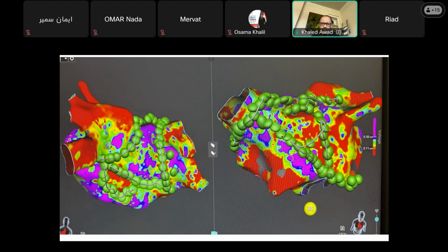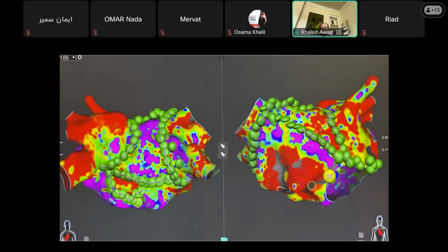I believe, yeah. So just two different projections here. That's my approach. I was also going to probably address some of the septum, but then he also had a very aneurysmal septum. So I thought a lot of that voltage is just a function of the aneurysmal septum. You couldn't get good contact force. So anyway, that's the case I was talking to you about.